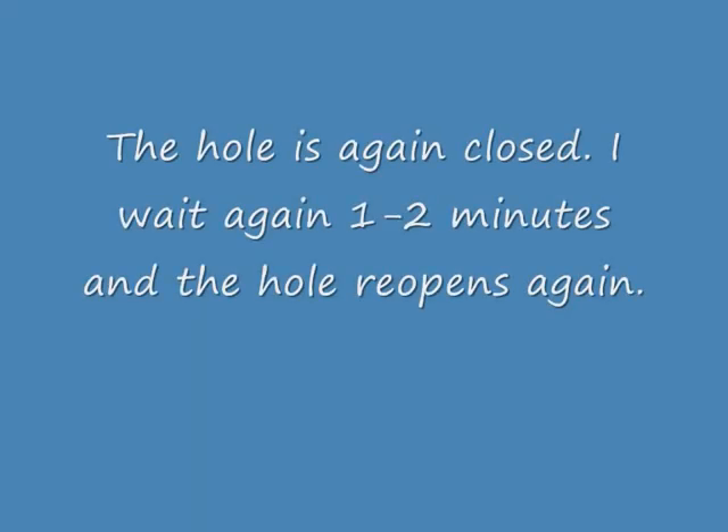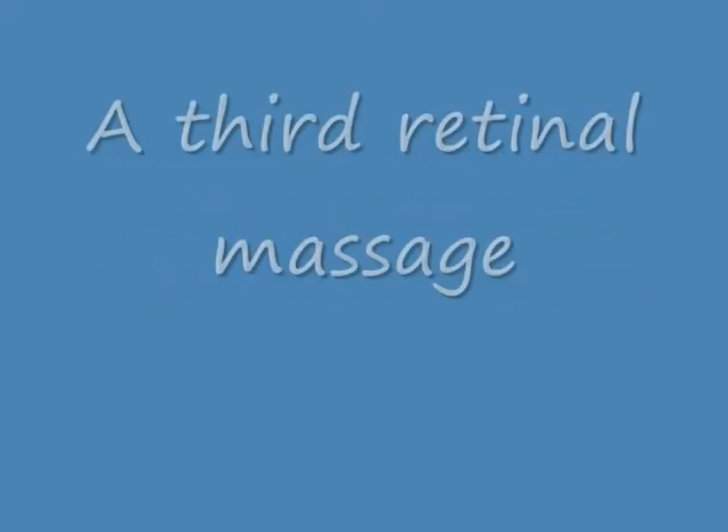Please watch now — it opens again. During this vitrectomy the hole opened several times, so I had to repeat the retinal massage several times. It is very important to wait one to two minutes after the hole is closed to see if it may open again. You must have patience.